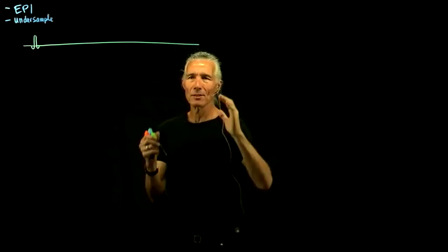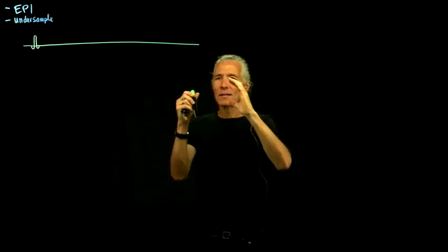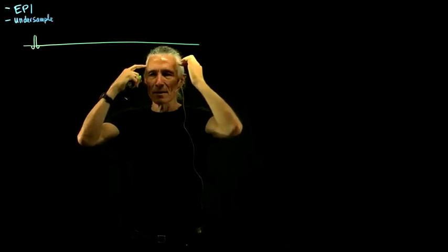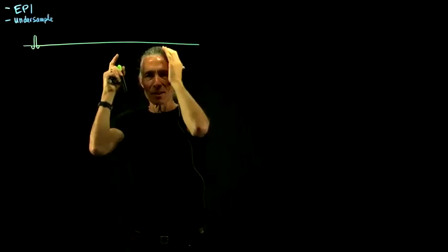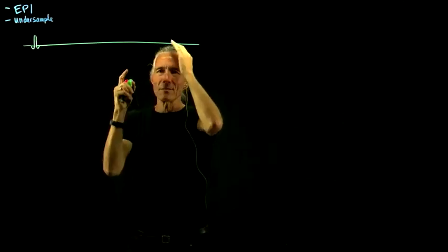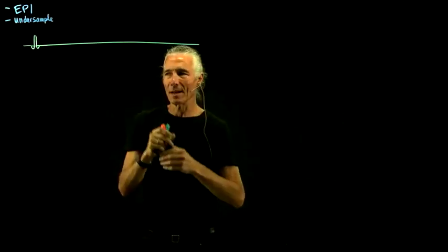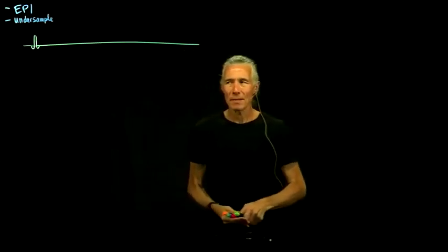You'll get a little band of fat, the bit of fat underneath your skin on your skull, shifted over. On one side it'll stick out in the air, and on the other side it'll go into the brain. Obviously that's going to mess up your image.